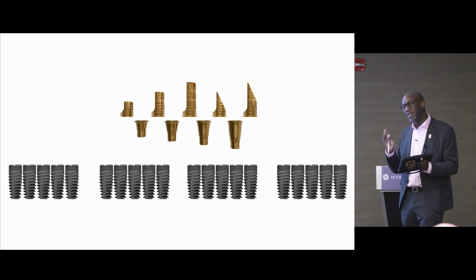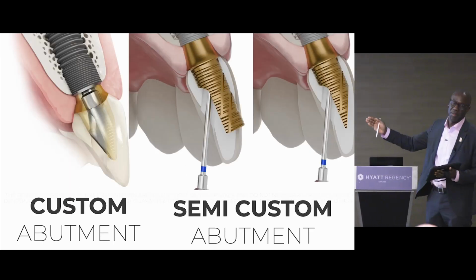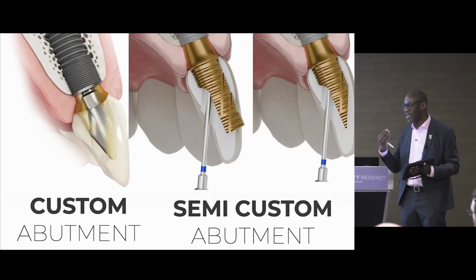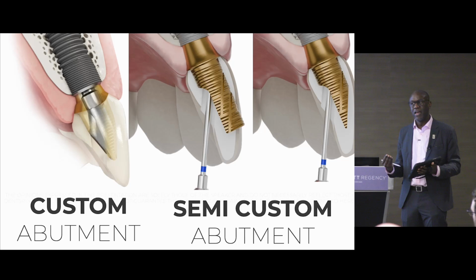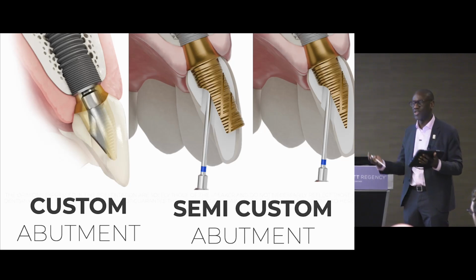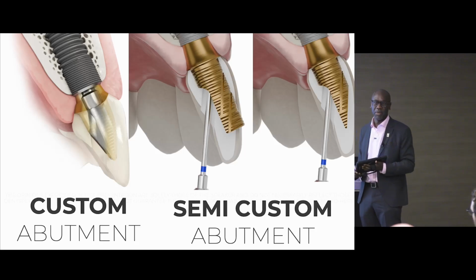So this means we're entering a new phase in terms of what's available to us. In the past, we've had custom abutments. This we call a semi-custom abutment, i.e. you can customize it to a certain degree, but it comes as a stock component. So it's fitting into this really nice zone where we can use the customization, but it's a stock component we keep in place.